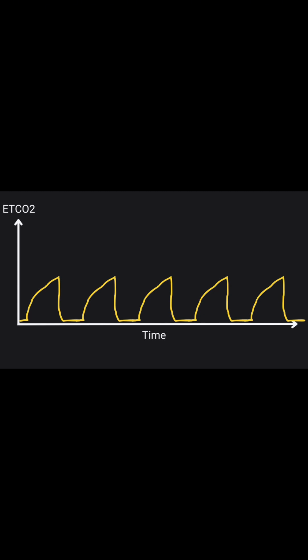Well, why is that? It's because bronchospasm narrows the airways. Air escapes slowly instead of quickly. You get some gas trapping. The worse the bronchospasm becomes, the larger the shark fin becomes. As bronchodilators work, so you're giving your patient Atrovent, Ventolin, you'll actually watch the waveform become much more square. That's one of the few monitors that lets you actually watch treatment working in real time.